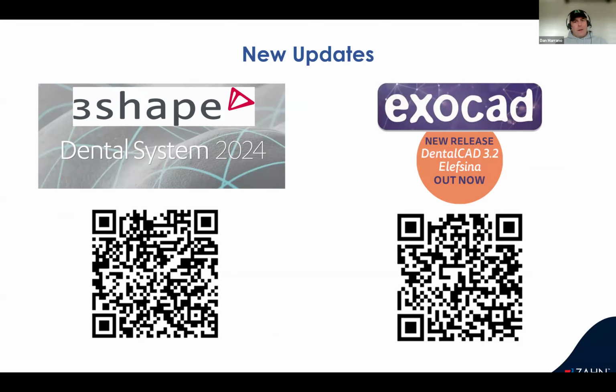And back to the actual software here. Both of these have new updates. Most of the presentation was done in 2023 3Shape. exocad 3.2 has some new features out. These are the QR codes to take you to their pages to show their updates.